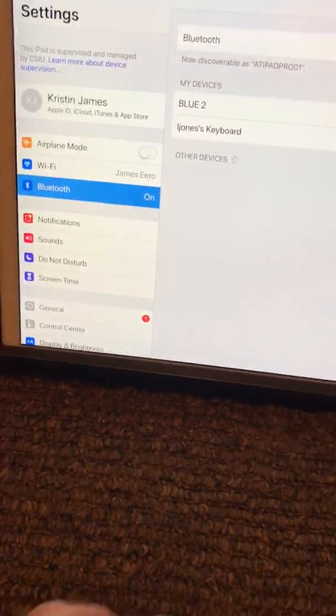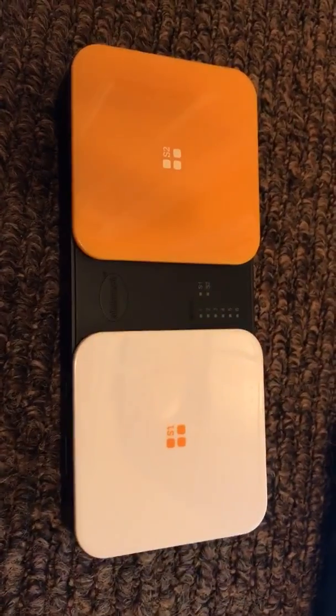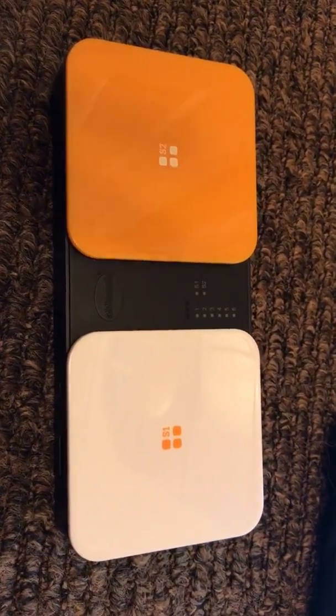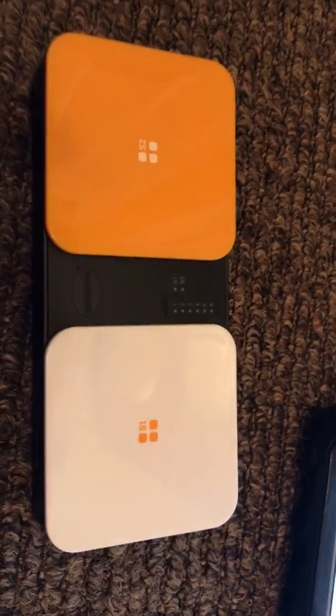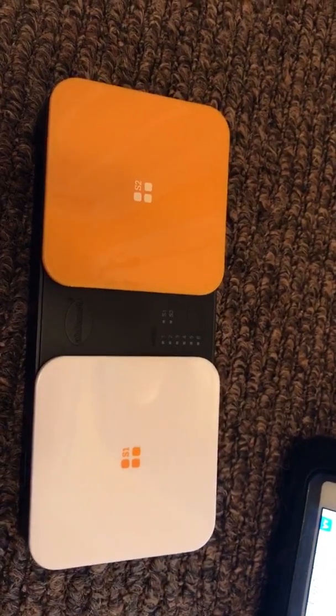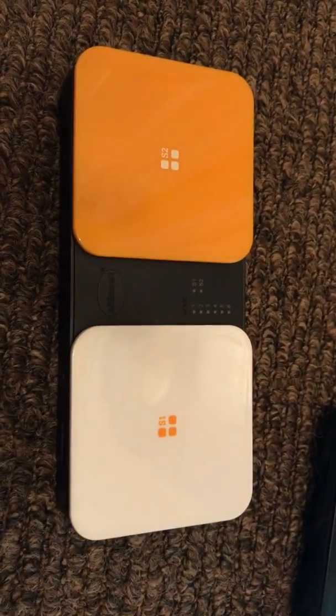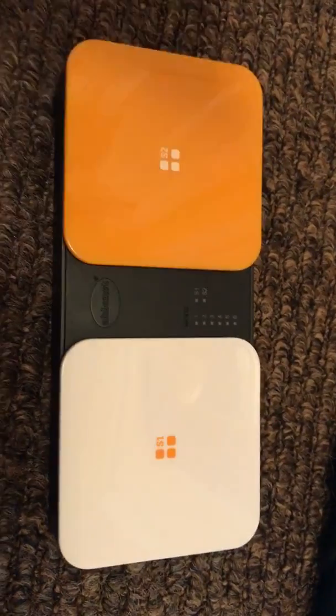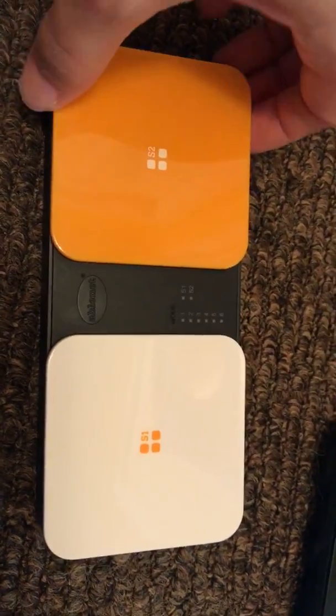Today we're going to learn how to use the Bluetooth switch to run programs and apps on the iPad. The very first thing you need to do is charge up your Bluetooth switch. It has a spot right there where you're going to put in your cable and connect it to the wall.